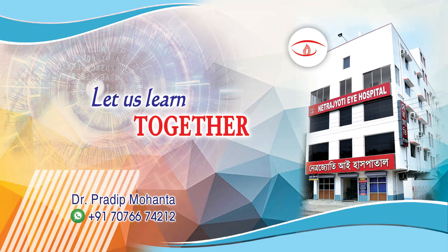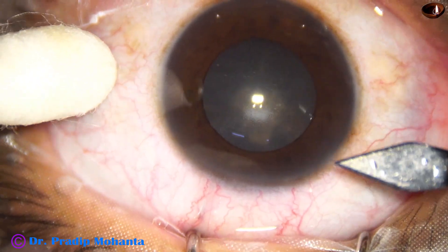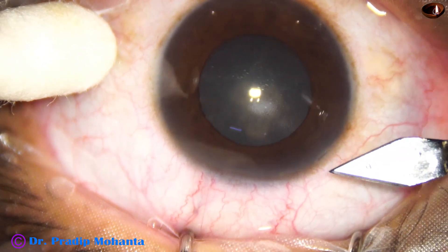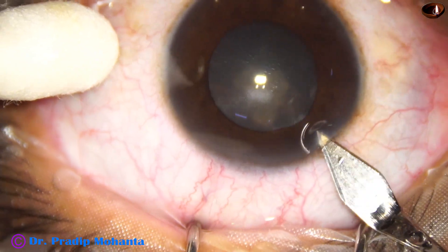Welcome to my workplace at Rana Ghat, West Bengal, India. This is a posterior subcapsular cataract. The patient is young, about 42 years old lady, and the nucleus is clear. There is only posterior subcapsular opacity.